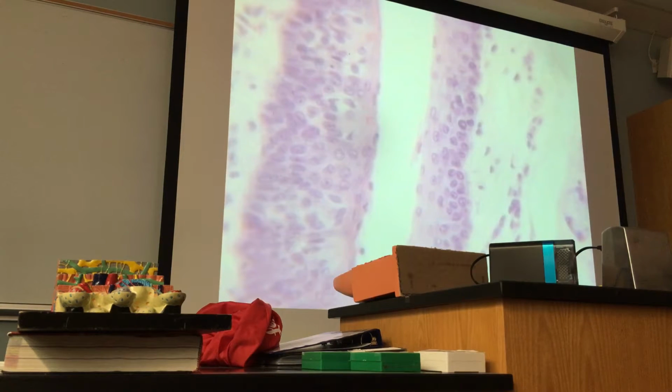But I'm going to show you the mother of all taste buds. And they are wonderful. So here we go, because you might have to identify a taste bud.